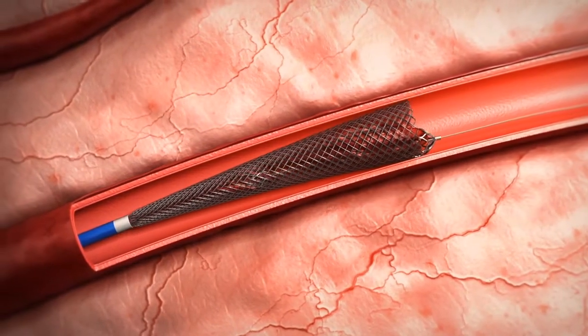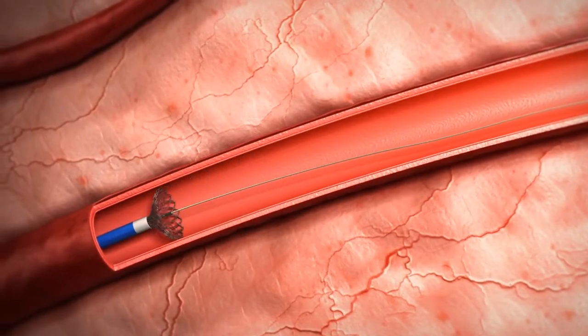Continued pulling collapses the trumpet with the cages and the clot into the sheath and out of the body.